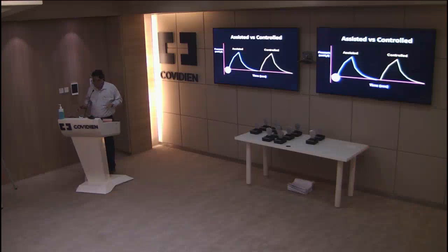But like I said, most of the time in the ICU, you almost never put them on control mode, because then it's more likely to cause some kind of diaphragmatic atrophy, etc. So unless for some reason, raised ICP or severe status epilepticus, you need to paralyze them, by and large you allow assist control. It means you allow the patient to make some effort. Except in the theater, where they have control mode. In the ICUs, by and large, we try and use assist control unless there is some exceptional circumstance.